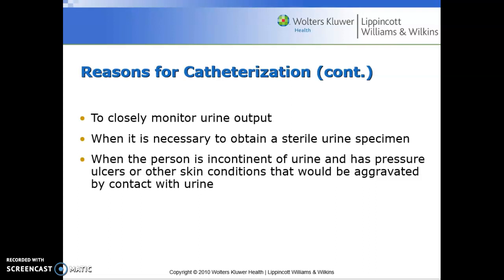We always start with a straight cath when we're thinking about retention, and we'll empty out. So we'll start with the straight cath, and then hopefully we'll get them back going on their own and independently. But if we don't, they may advance from doing straight caths into an indwelling or a Foley.